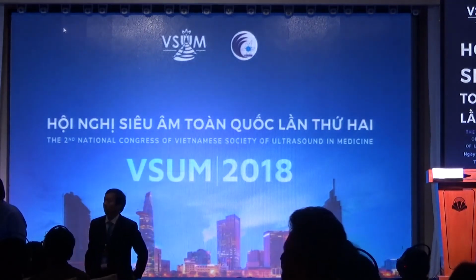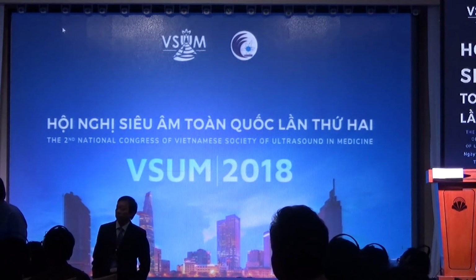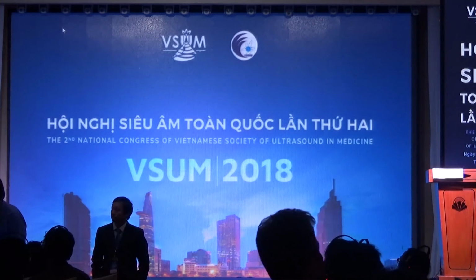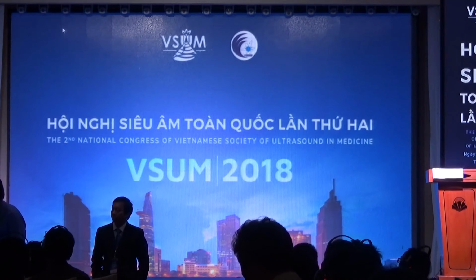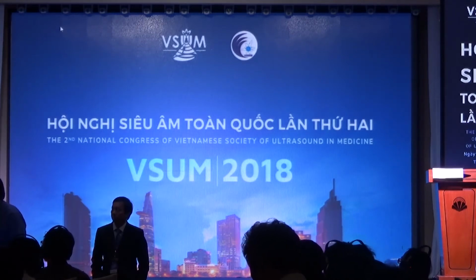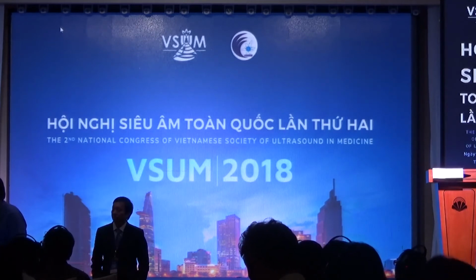And the pulsatility in the portal vein: when the pulsatility is more than 40% in the portal vein, then you can be sure it's also a sign of congestive heart failure. So I have a few things. The take-home message is ask for contractility using echocardiography, look for pro-BNP in the laboratory data to exclude it, and the other ones we add in our examination.